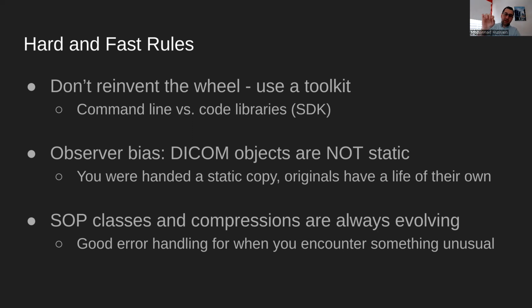I'll even take this advice as far as saying that if you find yourself managing a lot of DICOM files, say you're in the middle of a research project, instead of storing these files in directories in your file system, I would actually recommend taking a little bit of time to stage an open source PACS implementation and use that to manage your DICOM files. You will thank yourself down the road because it just makes that much more sense.